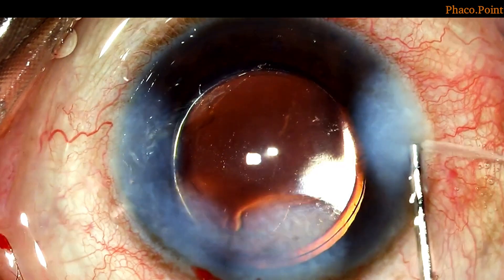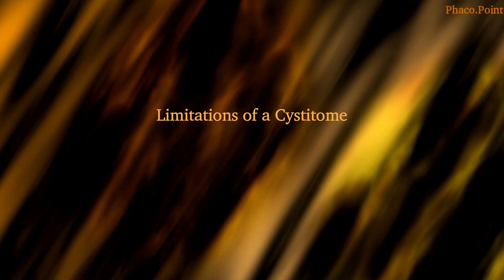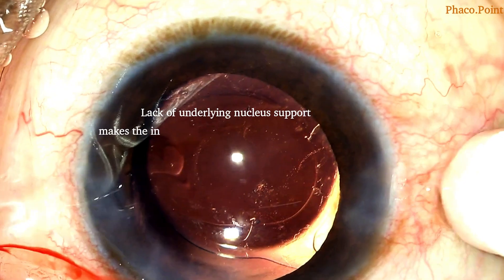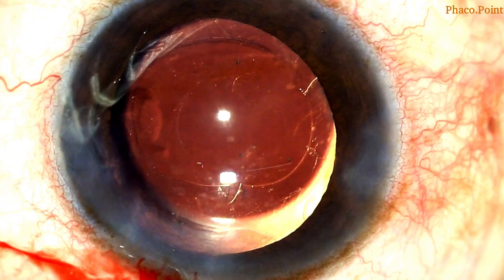And now you can see a suitably enlarged RHEXIS. However, this technique of enlarging the RHEXIS with the help of a cystotome comes with its own limitations. The lack of the underlying support of the nucleus makes it rather difficult to create the initial tear in the RHEXIS edge, and the tear that is eventually created with the cystotome is more like a notch.